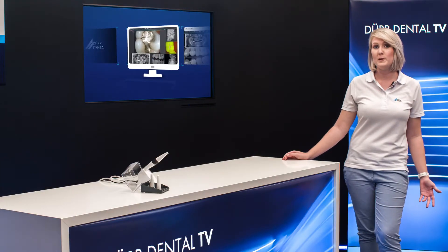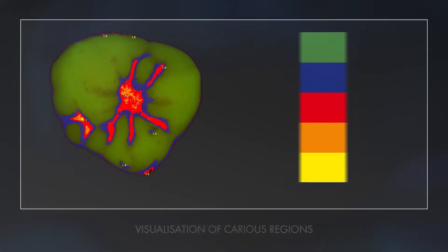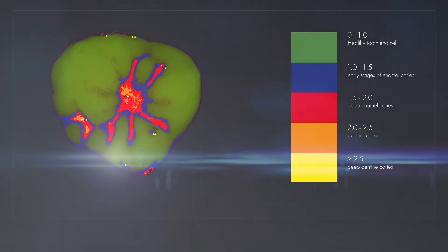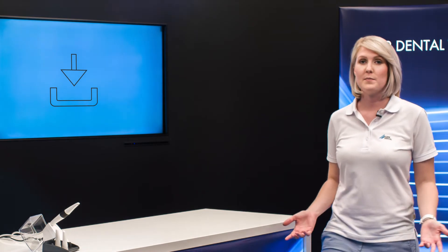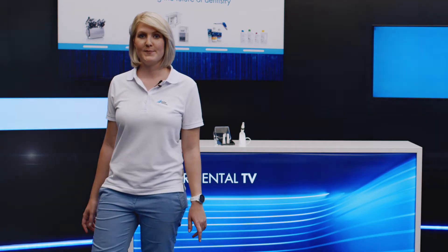The Vistasoft imaging software is included in the package. You can use it to evaluate the proof images on the monitor straight away. Carious lesions are highlighted in colour and the corresponding caries are shown with a numerical value. It's really easy to save all your images and retrieve them at a later date. So you can check on lesions as part of a follow-up appointment and discuss them with the patient at an early stage if they are found to be progressing.